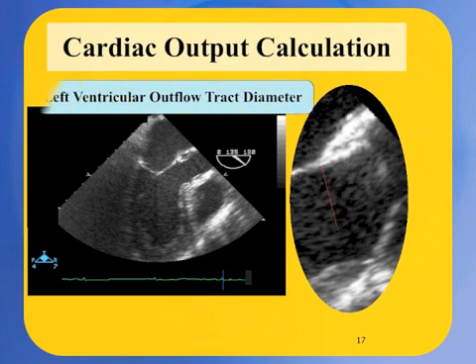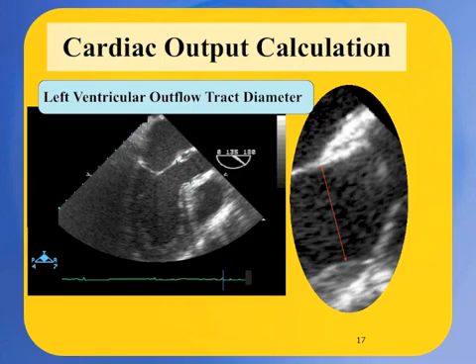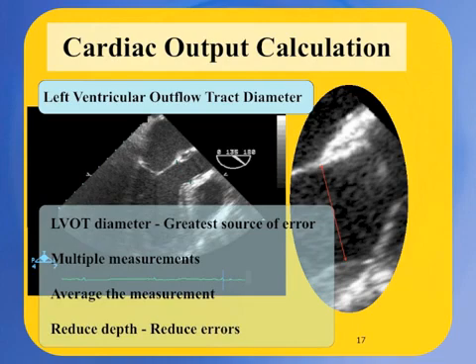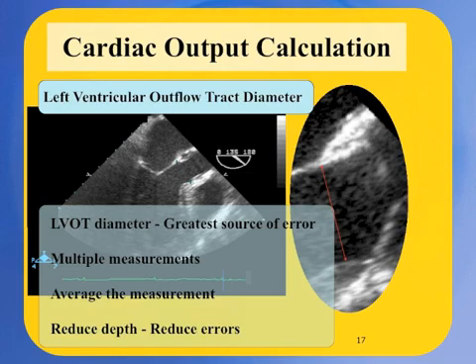Measurement of the left ventricular outflow tract diameter is conducted in the mid-esophageal aortic valve long axis view at 100 to 120 degrees. The LVOT is measured within 1 cm of the aortic valve with the walls parallel and the valve open. Since this number is squared in the process of calculating the LVOT area, it becomes the greatest source of error in the calculation. It is thus prudent to conduct multiple measurements of the LVOT to ensure accuracy, and it is best to average these measurements. Reducing the depth of imaging can aid in obtaining better resolution and improving measurements.